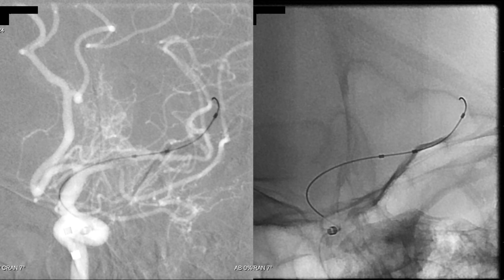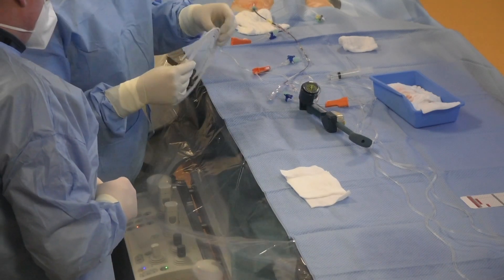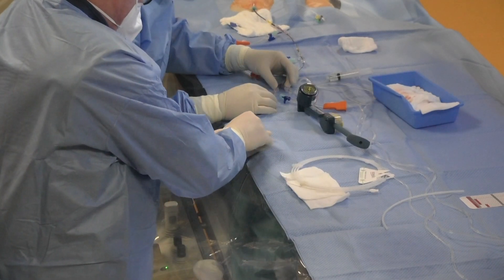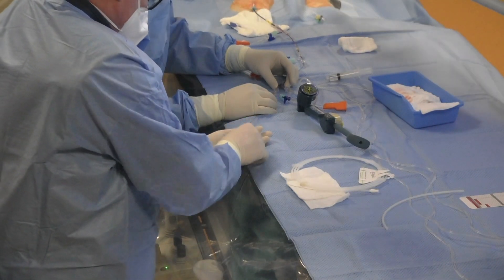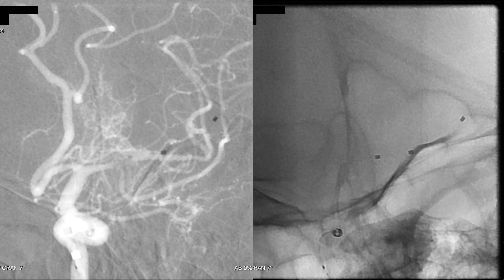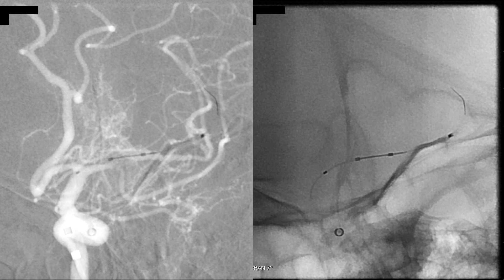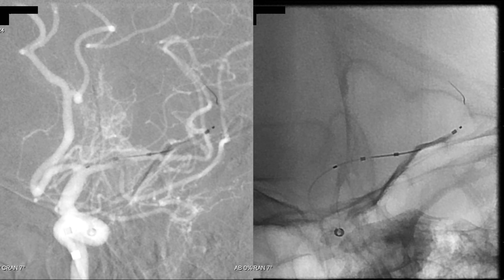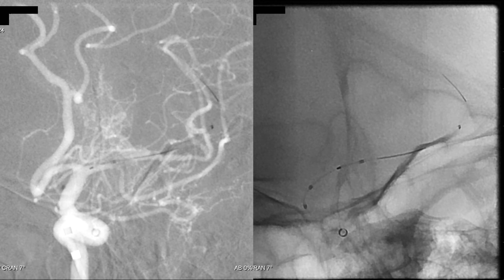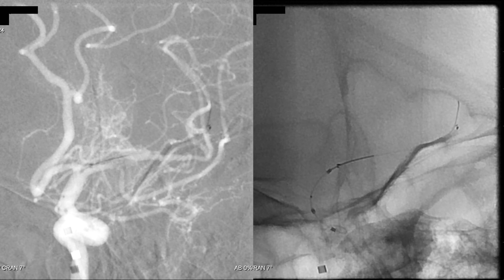Now we pull the micro wire. Here we have the micro stent, Credo Hel 3 by 25 millimeters. We insert the micro stent into the balloon microcatheter — this is the advantage of this system: you don't need to change to another microcatheter, you just leave it in place and insert the micro stent. We are positioning the stent in the entire M1 segment of the left middle cerebral artery, because it was dysplastic and hypoplastic along the whole M1 segment. We push the micro stent and pull the balloon microcatheter backwards. Now the stent is in place.